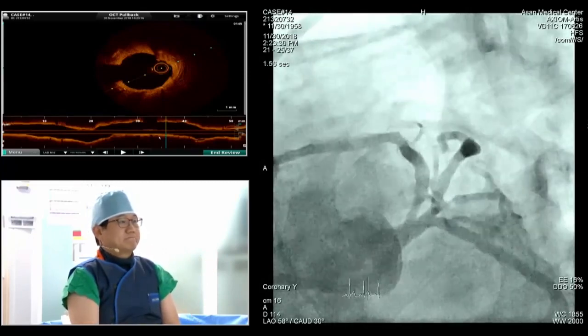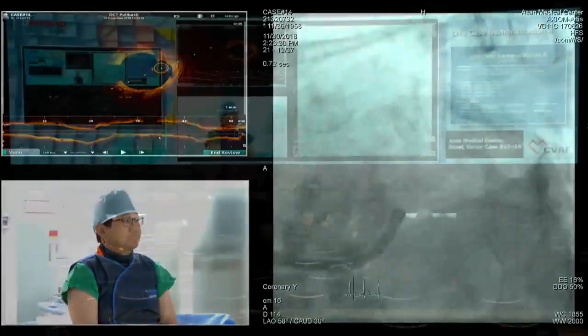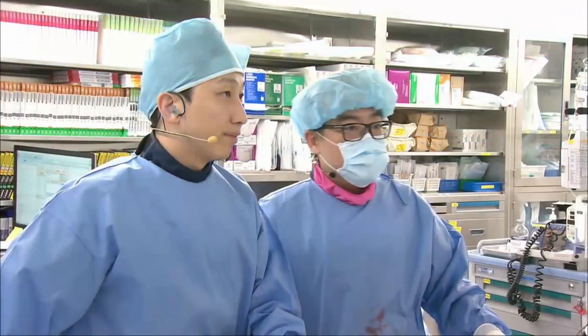Great. Thank you for nice cases, Dr. An. And so we want to move to Dr. Kao, Paul Kao. Can you hear me? Yes. All right. Yeah, we can hear you. We are almost done here. Almost. So let's go back to the rotational.